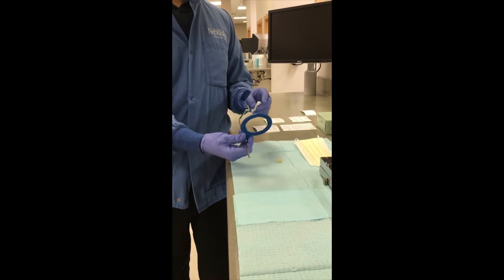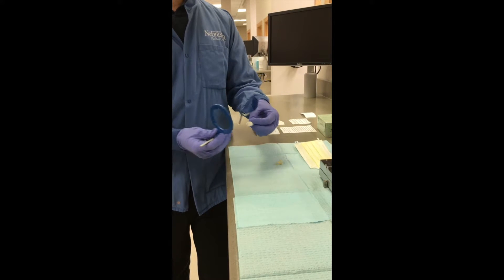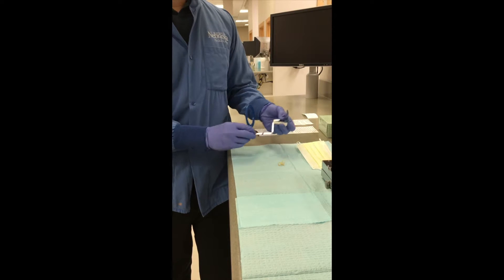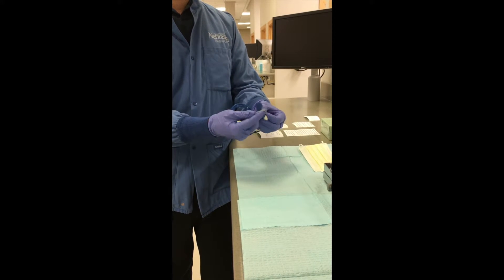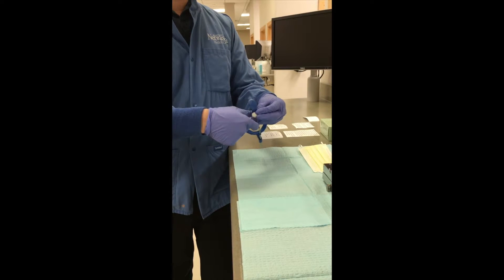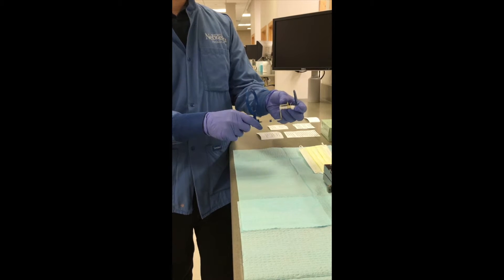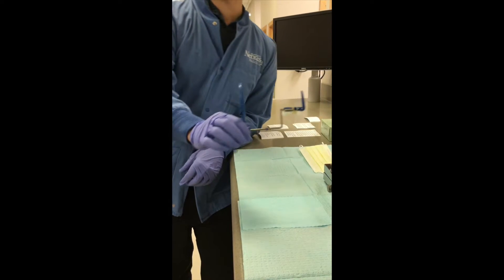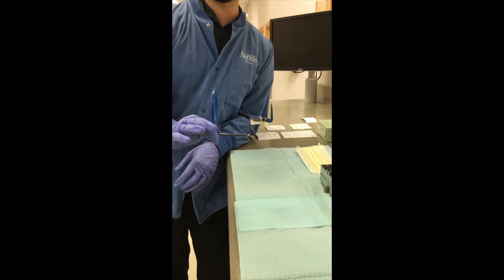For patient comfort and proper positioning of your anterior bite block, you're going to want to apply a cotton roll to the bottom of your bite block using a rubber band. Wrap your rubber band around your bite block a couple of times, and that's going to hold your cotton roll there, providing ideal positioning for your anterior bite block as well as patient comfort.